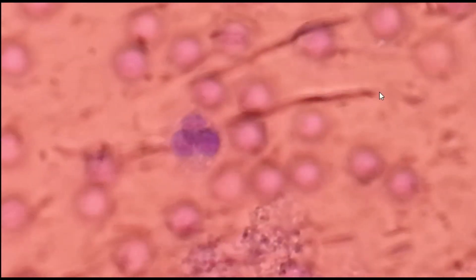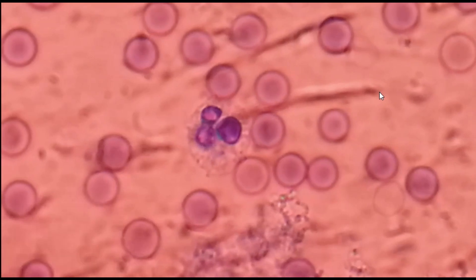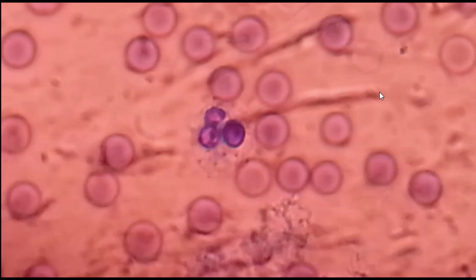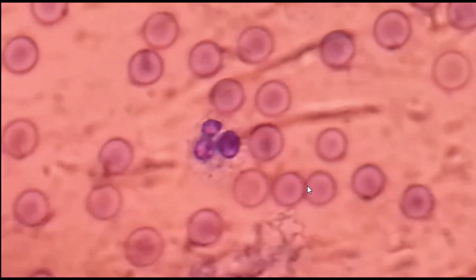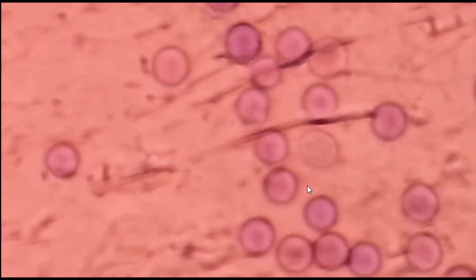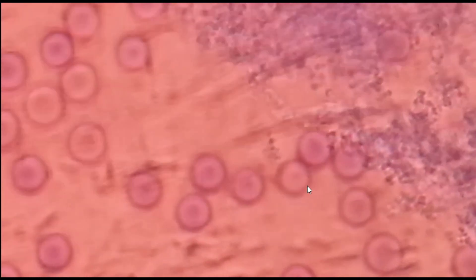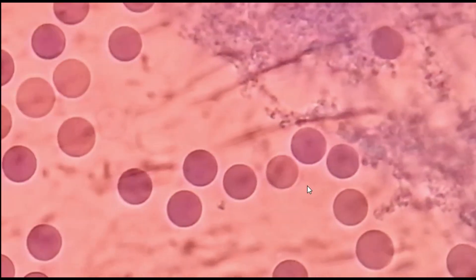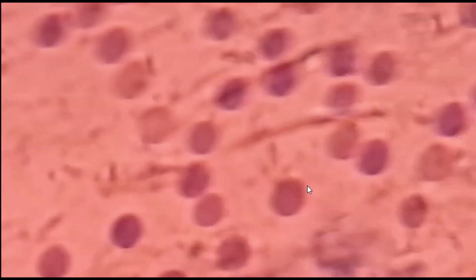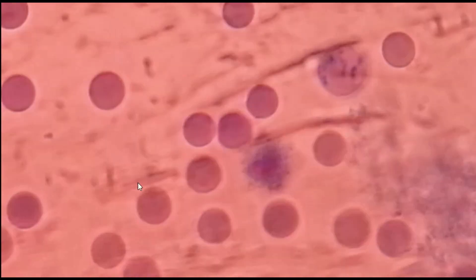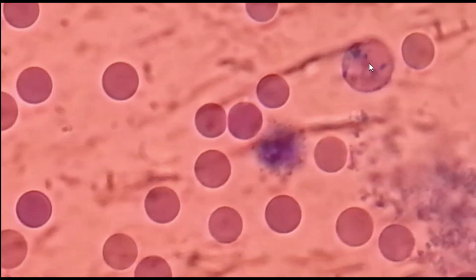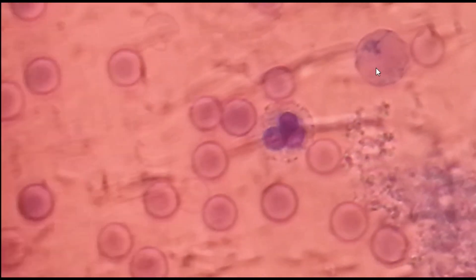New methylene blue also stains the immature form of red blood cells, that is the reticulocyte. Normally it is found at 0.5 to 2 percent of the red blood cell population. Here you can see — yes, this one is a reticulocyte, the immature form of red blood cell.